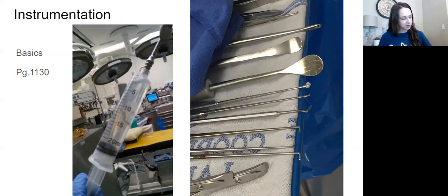Okay, so after that, let's look at retractors because that's what's in your book. So Weitlaner, Adson-Beckman, Adson cerebellar, you should remember all of those retractors. So spine retractors you should be okay with, but again, you should know every instrument in that orange book. I will stop at the brain retractors. So there's a picture after you keep going in the book, but I want you to know Leyla and the Greenberg brain retractors. I'm smiling because I worked with a surgeon who never used brain retractors, which is almost unheard of. So some of your supplies can actually be used for retraction, and we'll get into that when we get to supplies.